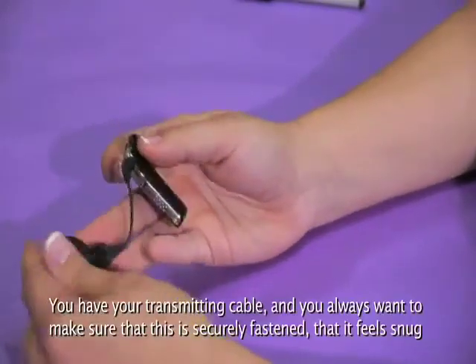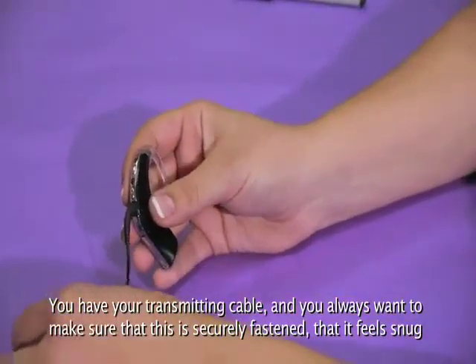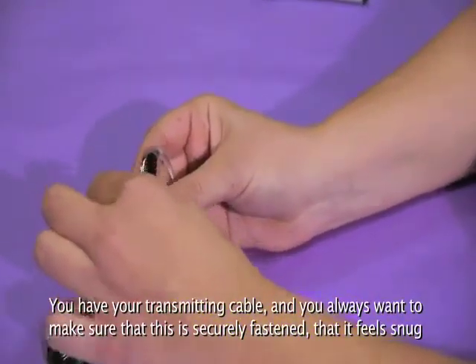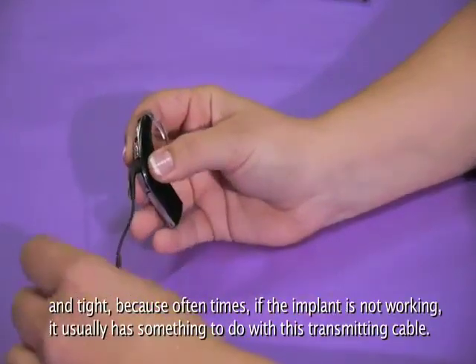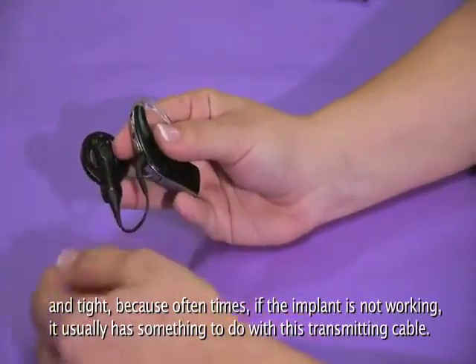You have your transmitting cable. You always want to make sure that this is securely fastened, that it feels snug and tight, because oftentimes if the implant is not working, it usually has something to do with this transmitting cable.